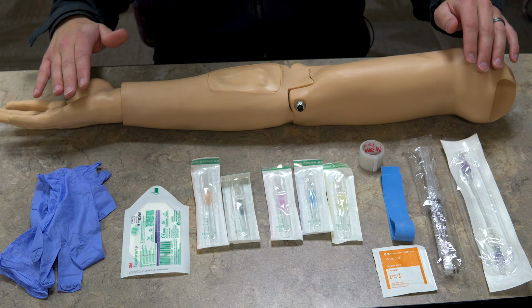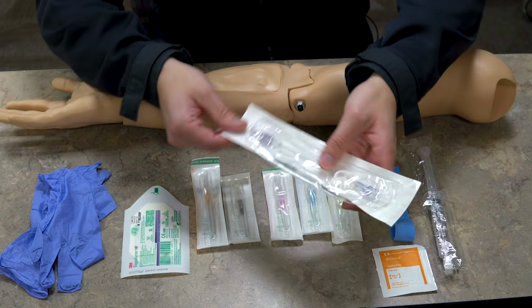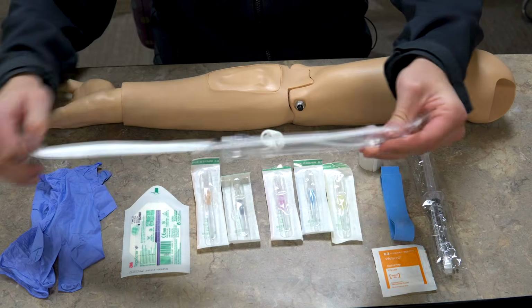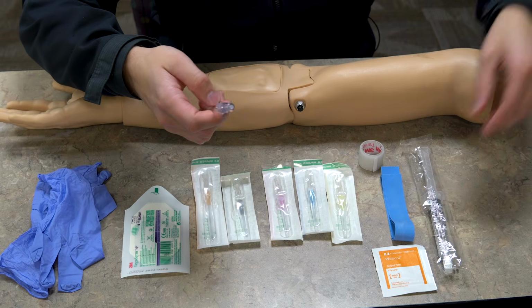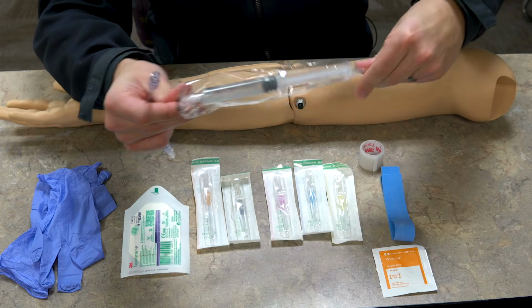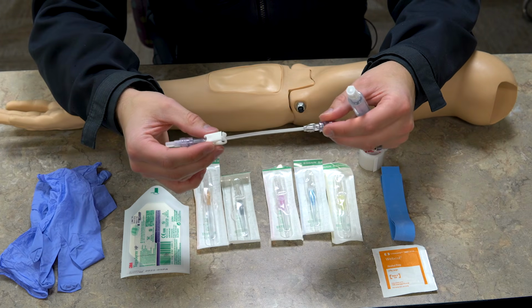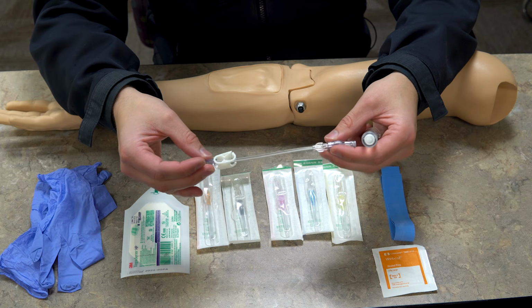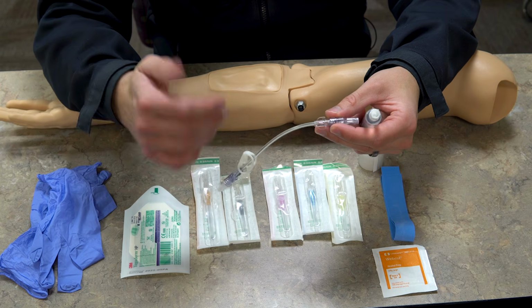So the first thing that I wanna do when I'm preparing an IV is set up whatever I'm going to be administering through. In this case, this is a loop. You can also hang a bag of fluid. For this, I'm using expired equipment, so this is what I could find. I might show you how to spike a bag of fluid later, but this works just fine. Now, a loop is something that's going to remain on the patient even if you're not giving them fluid at the moment. This is just going to stay in them and be taped to their skin, and then if you do have to give a medication, you can just push whatever you need.